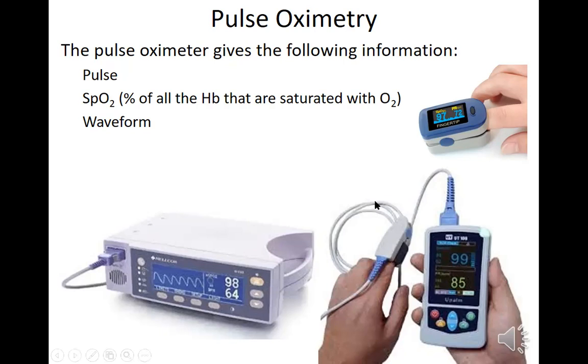mid-axillary or anterior axillary, and you can take a pulse that way by leaning into that area. You check pulses with your fingers, not your thumb, because that has a pulse. So SpO2, when you see SP, that's the pulse oximeter, because this is a peripheral pulse, not done by a blood gas, an arterial blood gas, which is different.